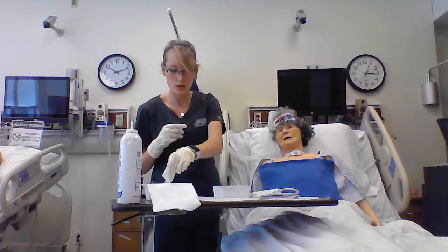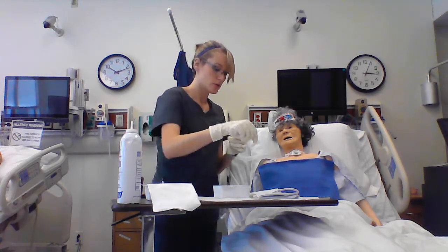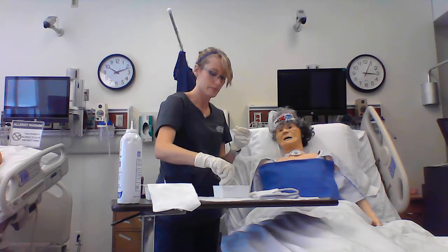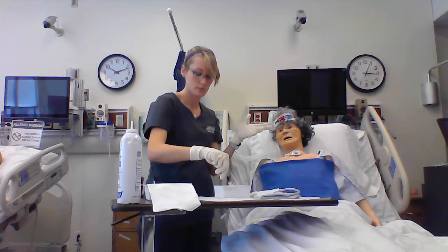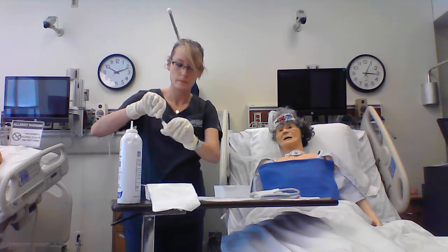So this dirty cannula needs to go into your hydrogen peroxide solution. Soak to remove any secretions. You can take this sterile brush that you have and you want to soak that in your sterile normal saline with your clean hand, sterile hand. And then pick this up to brush.